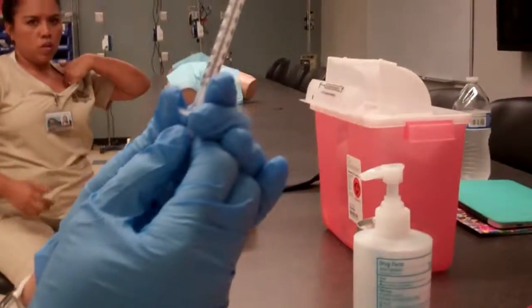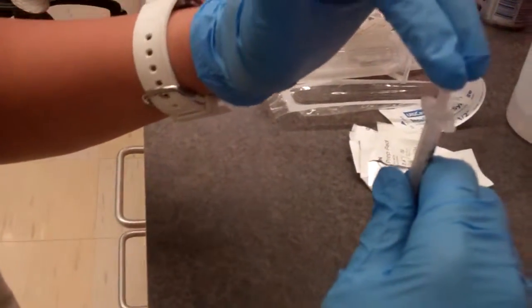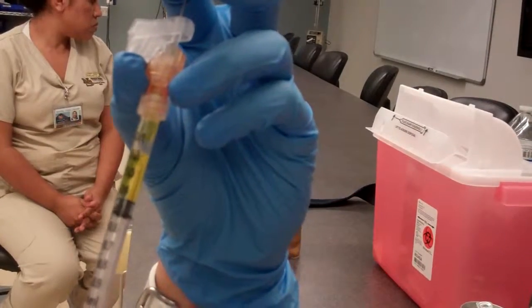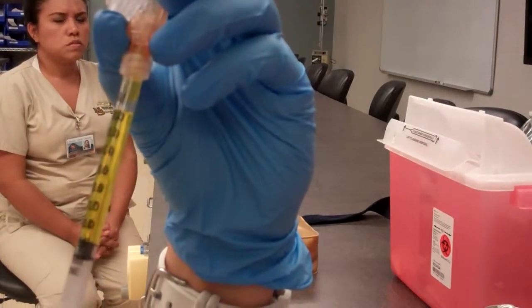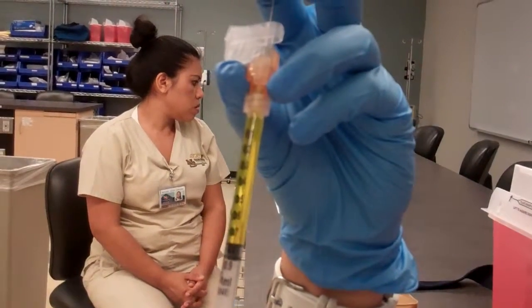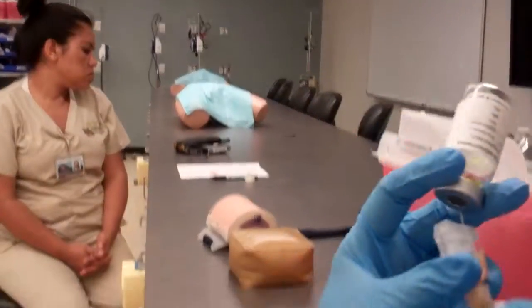I'm going to give 1 ml. And then I'm going to inject it. I'm going to withdraw. So I have 1 ml, no air. So I'm going to withdraw it. I'm going to stabilize my cap. Scoop it in. Place it.